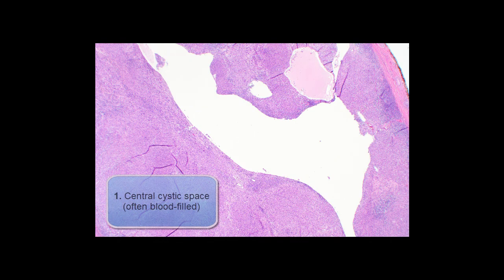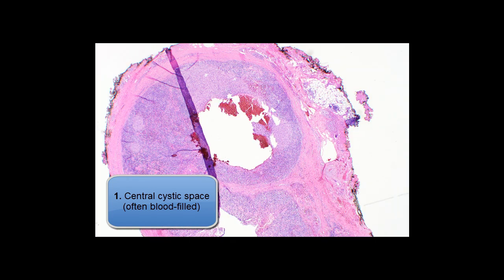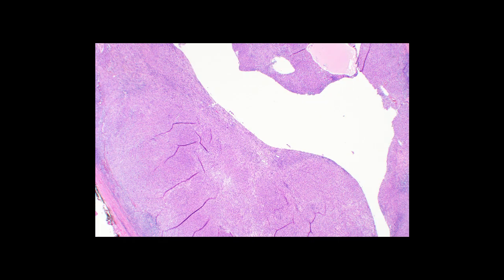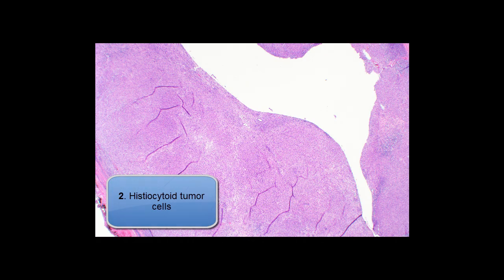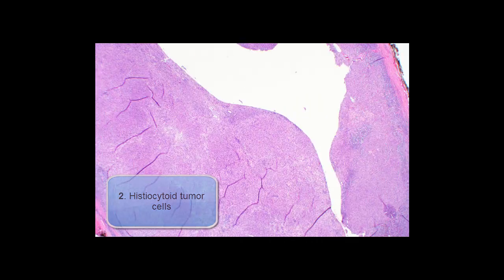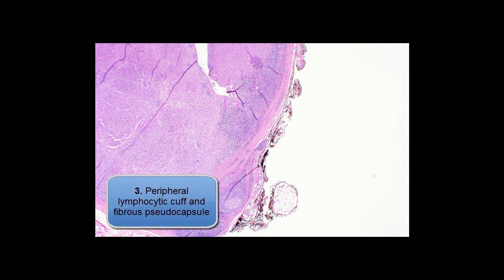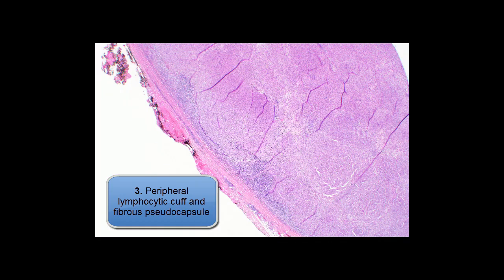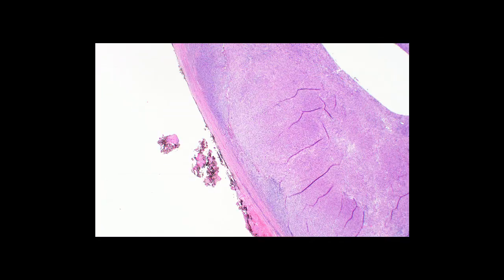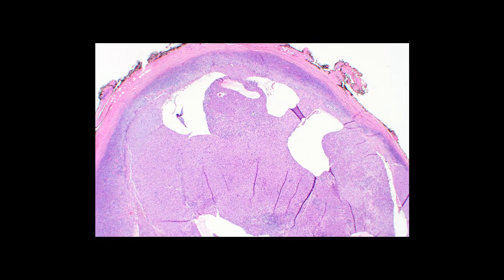From low power, these tumors have a very characteristic appearance. First, there is a central cystic space, often filled with blood. Second, there is a proliferation of histiocytoid tumor cells that form a sheet around these central cystic areas. And the third feature is at the periphery, there is a lymphocytic or lymphoplasmocytic cuff surrounded by a dense fibrous pseudocapsule, giving it a very distinct low power appearance.